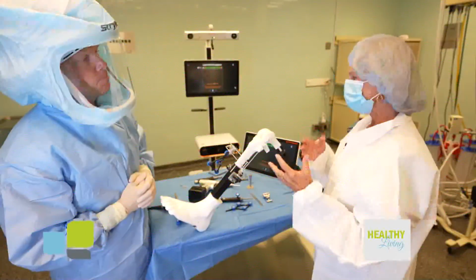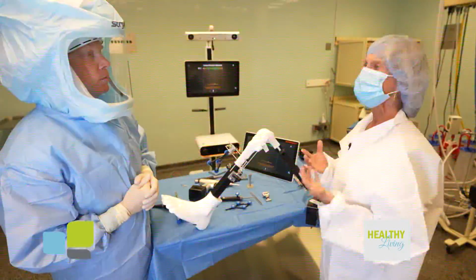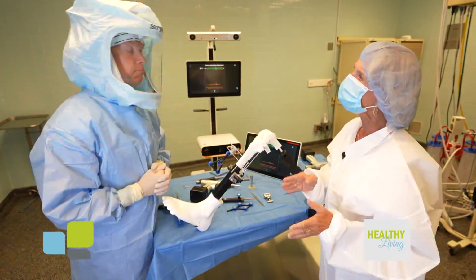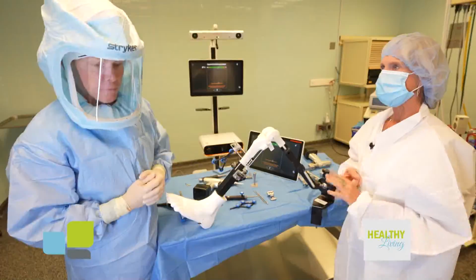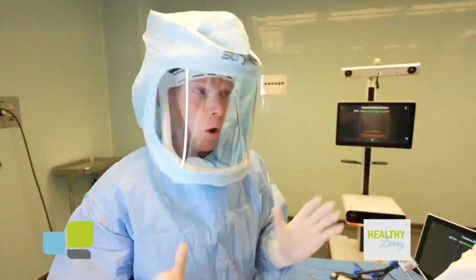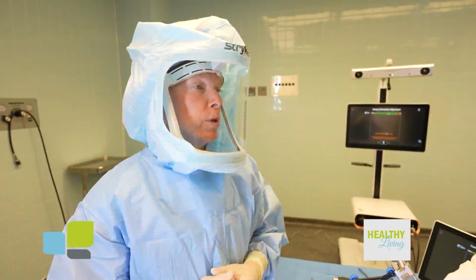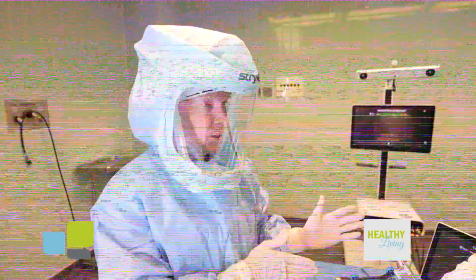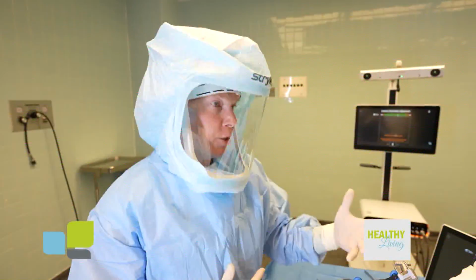Before we get involved in the actual knee replacement, can we talk a little bit about how much do you use the robot in your practice when it comes to knee replacements, number one, and at what point does someone need a knee replacement? Great questions. First, I am 100% adopter of the robot technology, so I use it for all my knee replacement patients. So that is partial knee replacements, which means you just replace a half of the patient's knee joint. And I use it for all my total knee replacements, where you replace the entire joint.